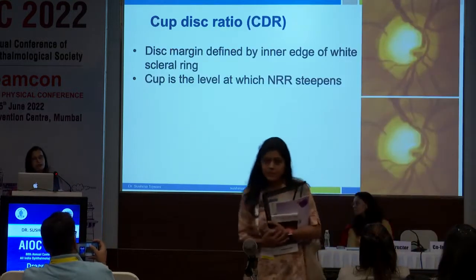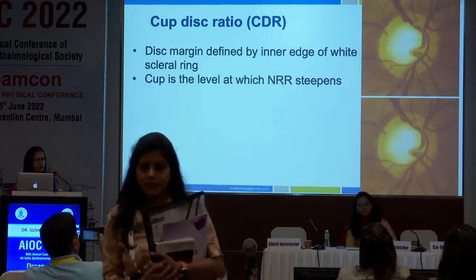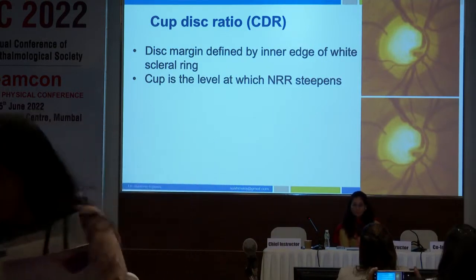So coming to the CD ratio, this is the most common thing that we document, when we see that CD is 0.5, CD is 0.3.